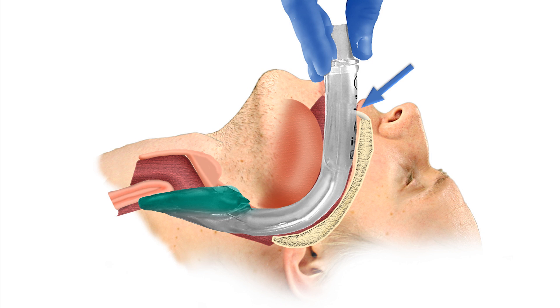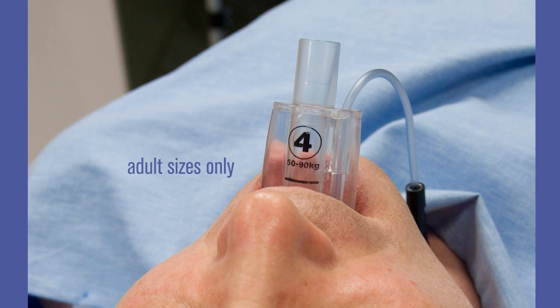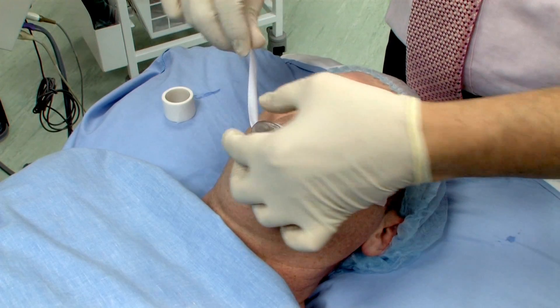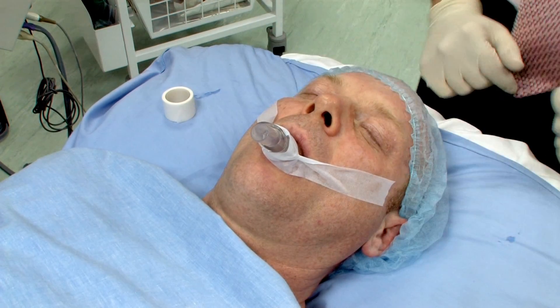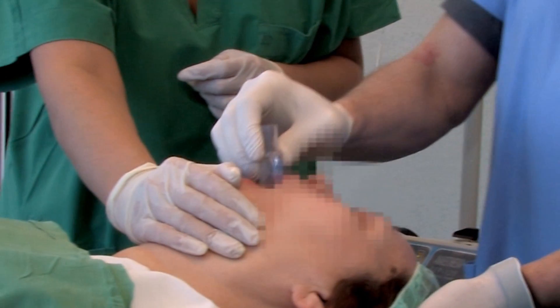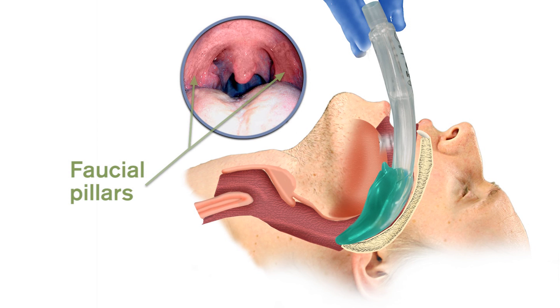The incisors should be resting on the integral bite block. The iGel has a horizontal line on the integral bite block to indicate the optimal position of the teeth, but the teeth may rest safely anywhere on the integral bite block. The iGel should then be taped down, maxilla to maxilla. It should be remembered that partial resistance and then a feeling of give way may sometimes be felt before the end point resistance is met. This is due to the passage of the bowl of the iGel through the faucial pillars — this is quite normal and consistent with correct insertion, but in such cases insertion needs to continue until definitive resistance is felt.